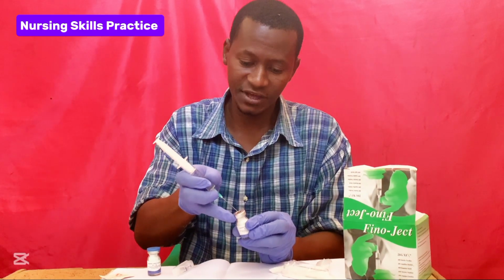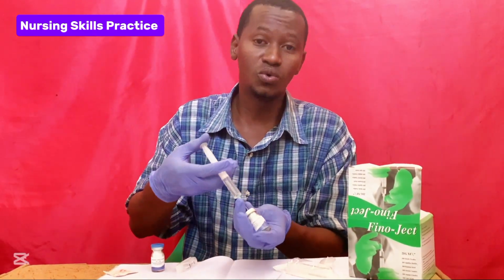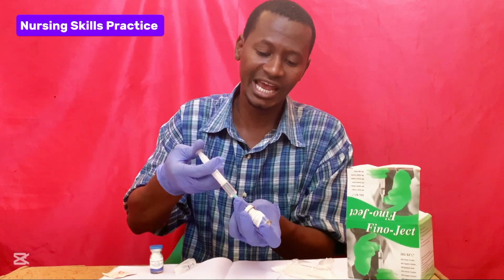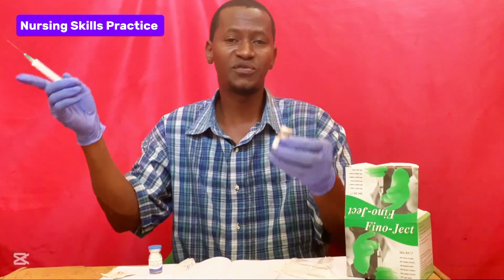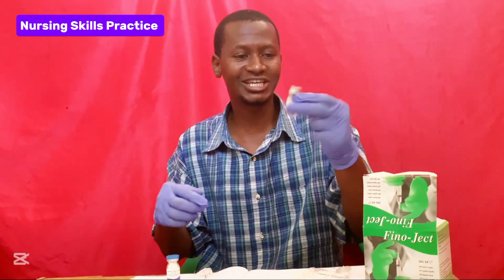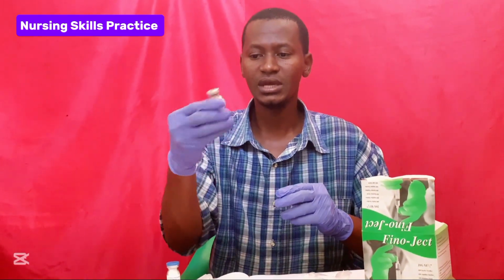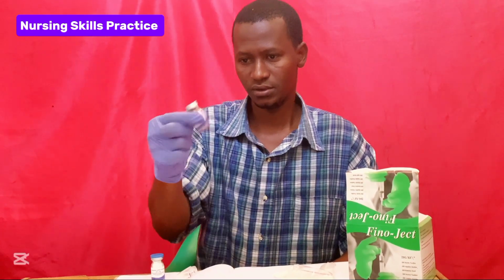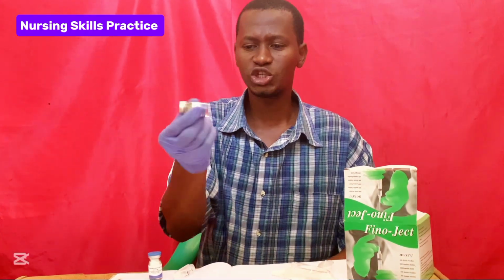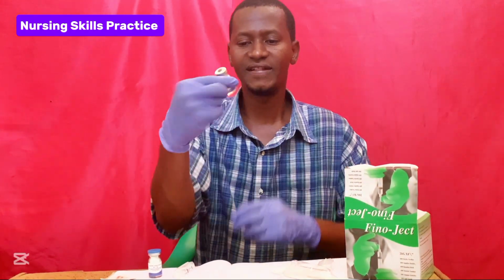So you inject the needle into the vial. Then you transfer all the sterile water for injection into the vial. Then you remove the needle from the vial. Then you start shaking it gently like this until the drug is completely dissolved. Make sure you shake it gently until all the solution is completely dissolved.